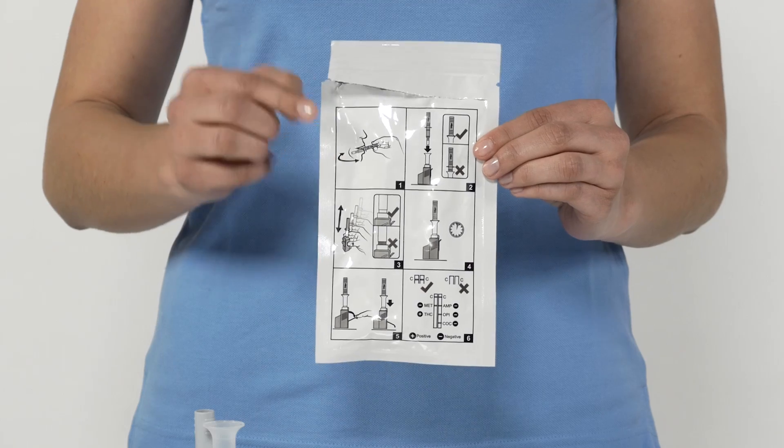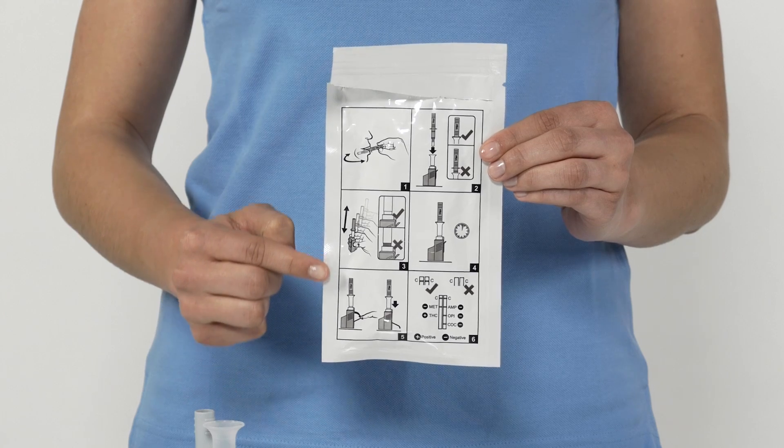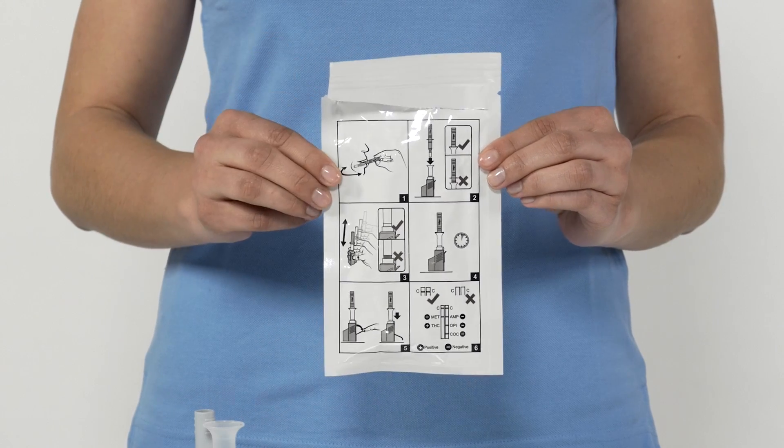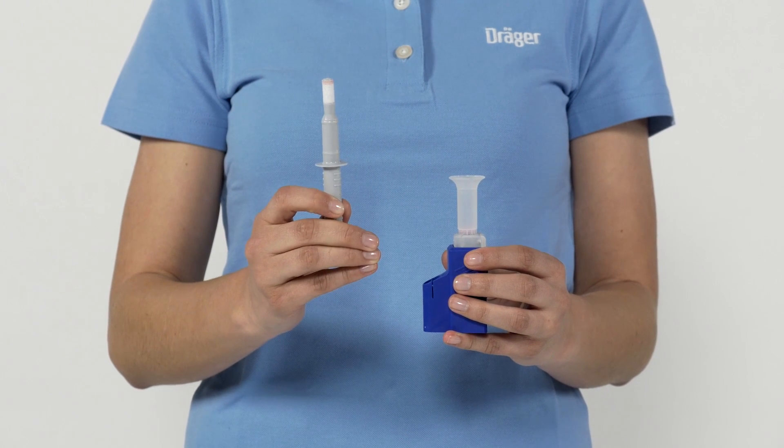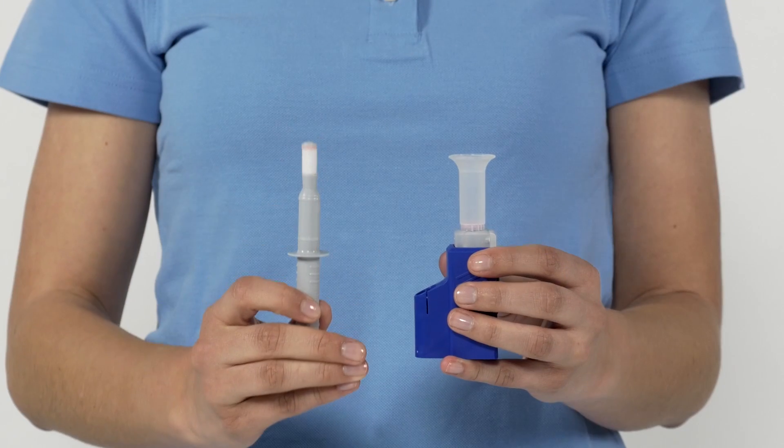The test process is shown again, step by step, on the back panel. The test kit consists of a sampler with a colour indicator for collecting a saliva sample, which you take out first, and a test cassette for the analysis.